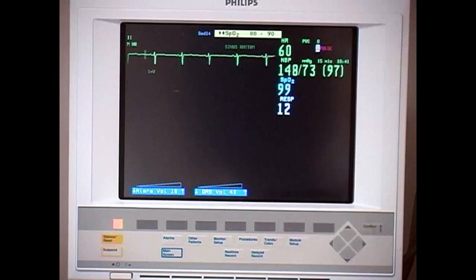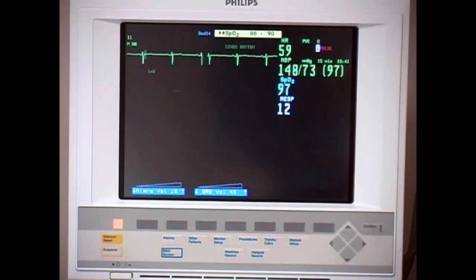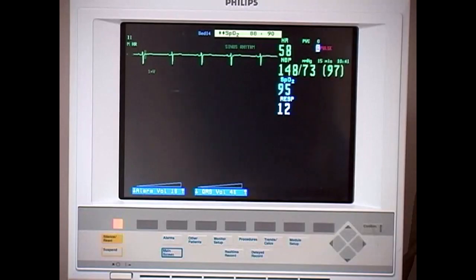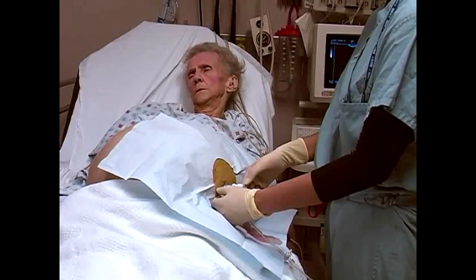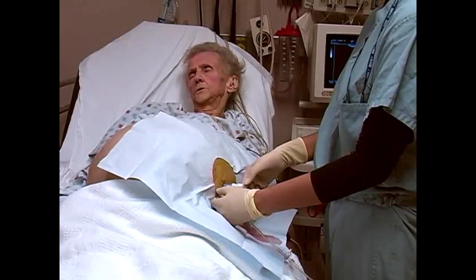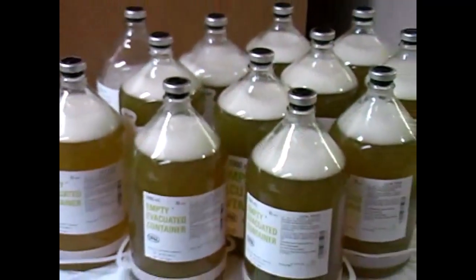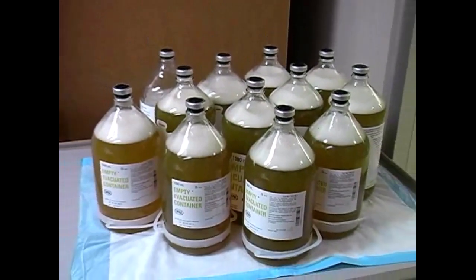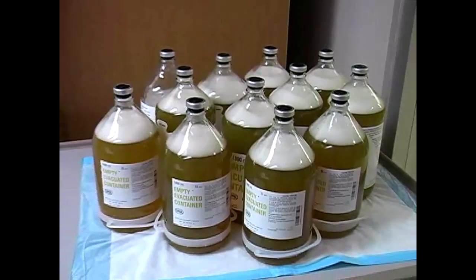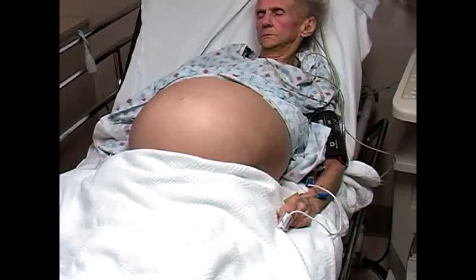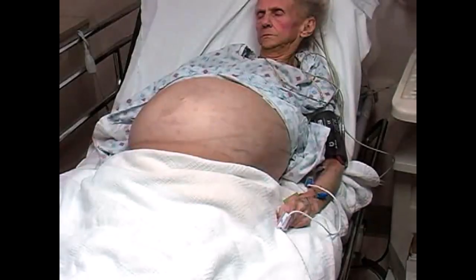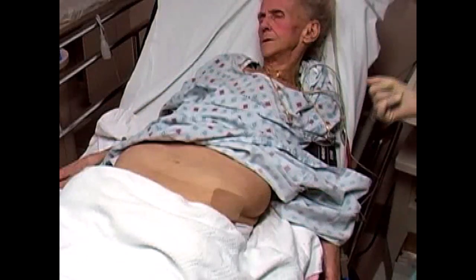During large volume paracentesis, it is essential to closely monitor the patient for hemodynamic changes, since fluid shifts may cause hypotension. The patient depicted in this video had refractory ascites due to cryptogenic cirrhosis and required palliative drainage of over 11 liters of fluid. The change in her appearance before and after the procedure is remarkable.